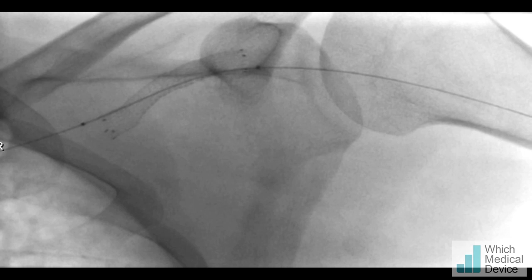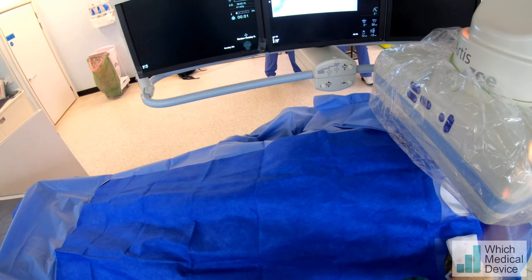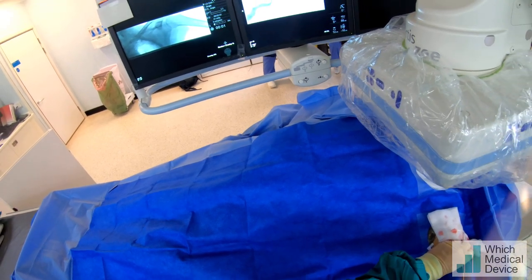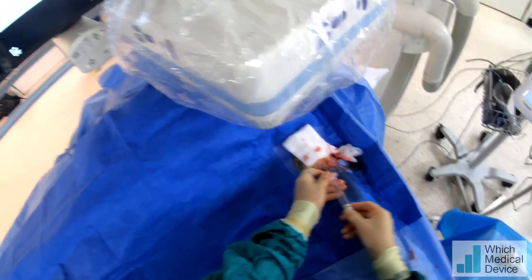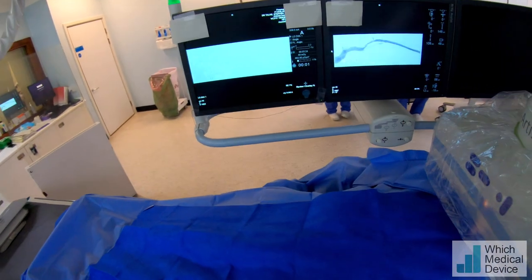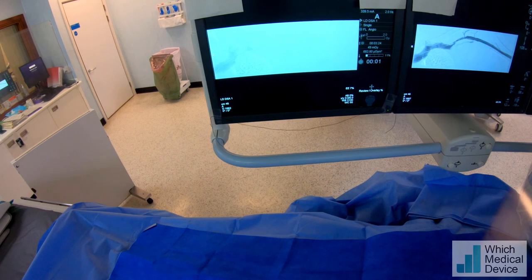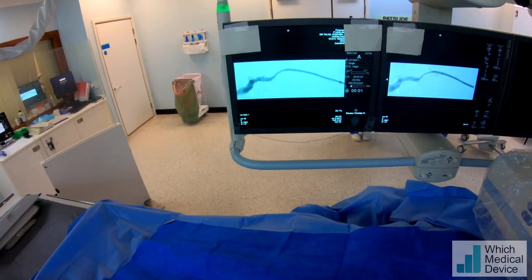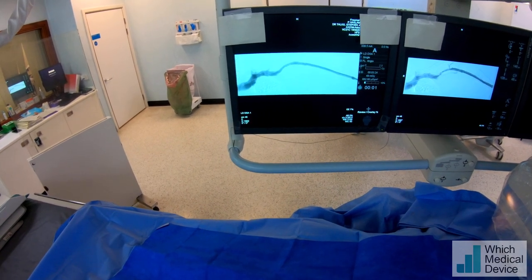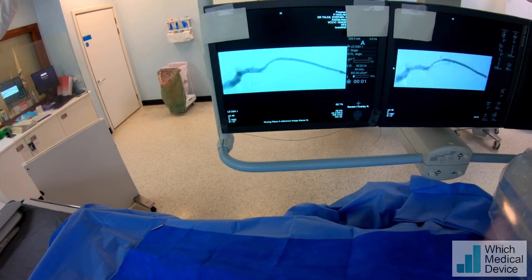Now we're going to take the delivery system out — we'll leave our wire through there of course — and we'll do another run to see whether that needs any post-dilatation. Breathe in again for me please, breathe out, small breath in and hold it there, nice and still — and breathe away. That flow looks excellent. I think what we will do is put that seven millimeter balloon back in and re-inflate it once just to see if we can get a little bit more dilatation there, but I'm very happy with the position of that stent.